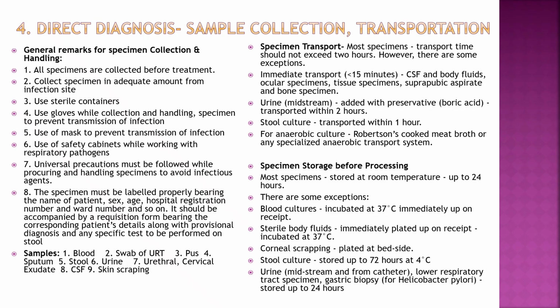All specimens are collected before treatment. Collect specimen in adequate amount from the infection site. Use sterile containers. Use gloves while collecting and handling specimens to prevent the transmission of infection. Use a mask to prevent transmission of infection. Use safety cabinets while working with respiratory pathogens. Universal precautions must be followed while procuring and handling specimens to avoid infectious agents.